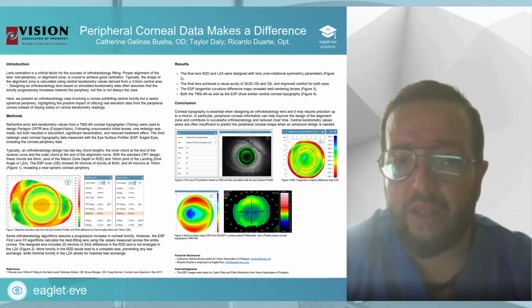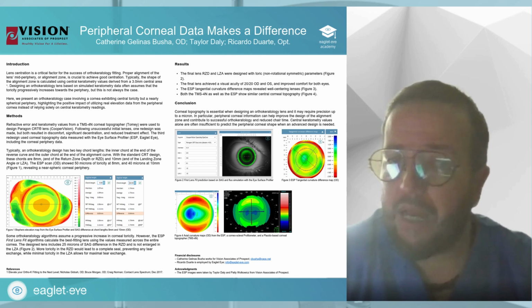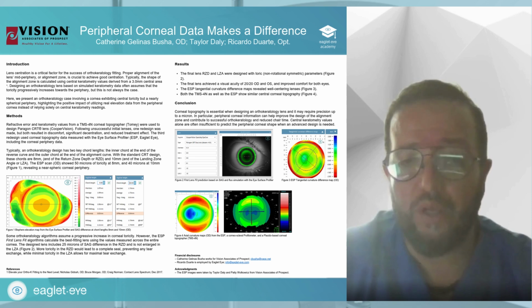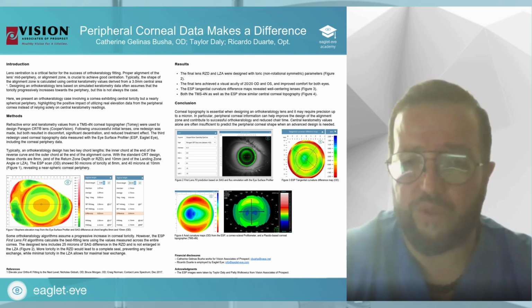They went again and just measured the cornea again, and they did the second remake of that lens. And again, there was lack of centration, comfort wasn't that good, and visual acuity wasn't that great as well. Because as you know, when the lens decentered, there can be some glare, and the vision could be a little bit worse. So they decided to go ahead and just do a scan with the ESP.